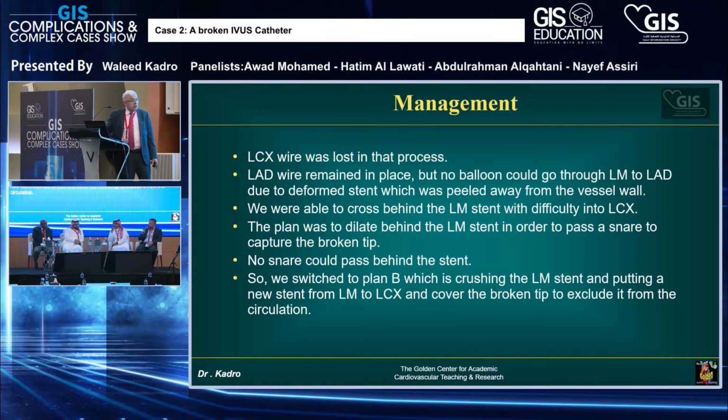There is a stent in the left main or no? There is a stent of the left main. And you crossed through the struts of this stent? Yeah. But you didn't dilate the struts from left main to CX? Well, I showed you I did POT in the left main. Yes, but you did not open the struts. You went through the struts with the IVUS catheter without dilating. Yeah, I just went from the stent to the circ and did the IVUS.